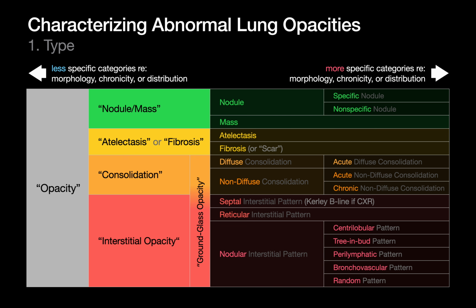But maybe I know more. Maybe I can say this isn't just an opacity, it's consolidation. And sometimes we can go much further. This isn't just an interstitial opacity, it's a nodular interstitial pattern, and actually it's a centrilobular pattern. So we're moving from broad to specific.